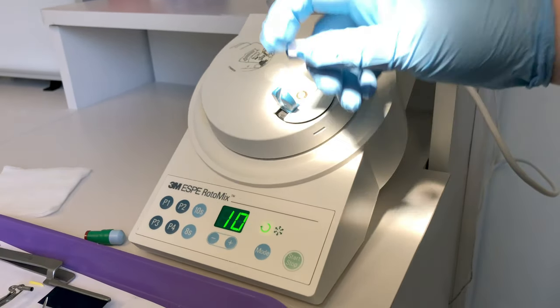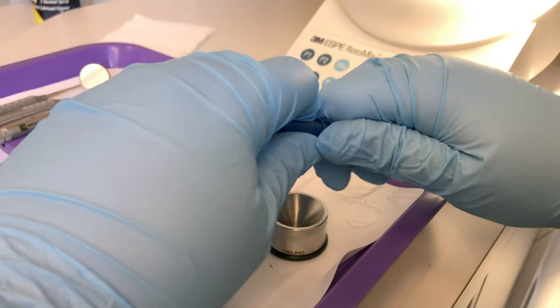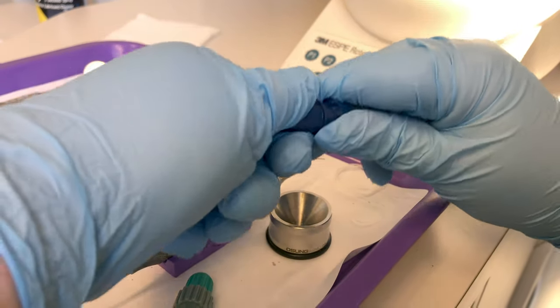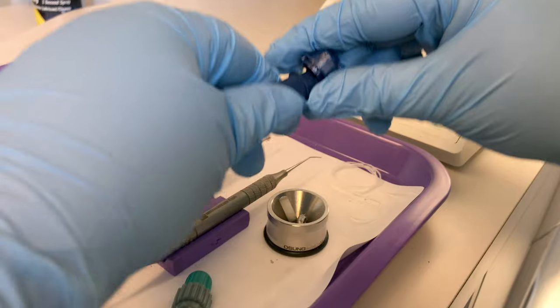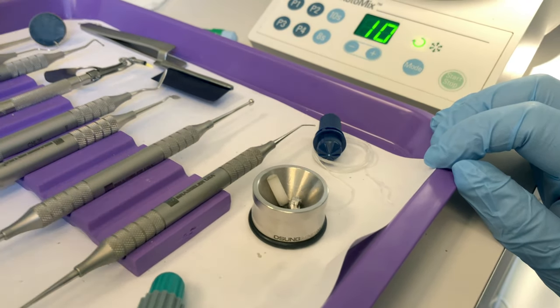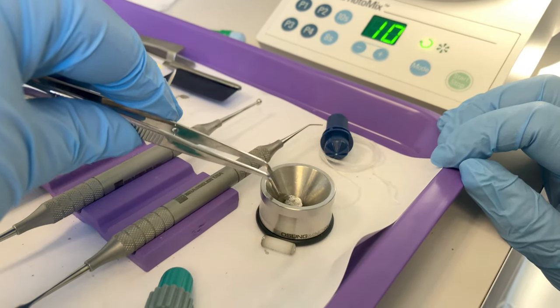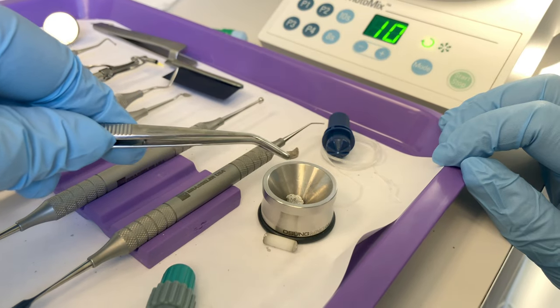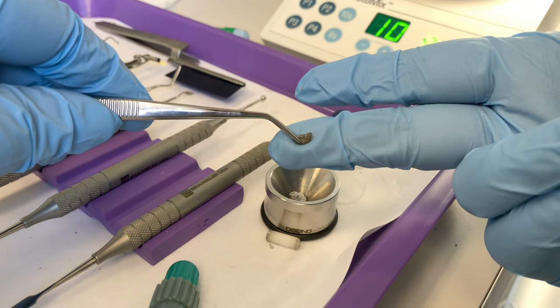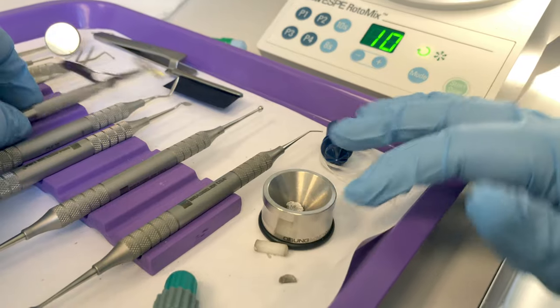Take your next capsule and load it into your triturator. Some triturators shake pretty vigorously, so I always like to hold the lid on them. For this capsule, pull it apart and let the contents fall into your well. What does the mixing is this pestle, and you may find a diaphragm — a plastic piece that separates the mercury from the powder in the capsule until we're ready to mix. Take those out.